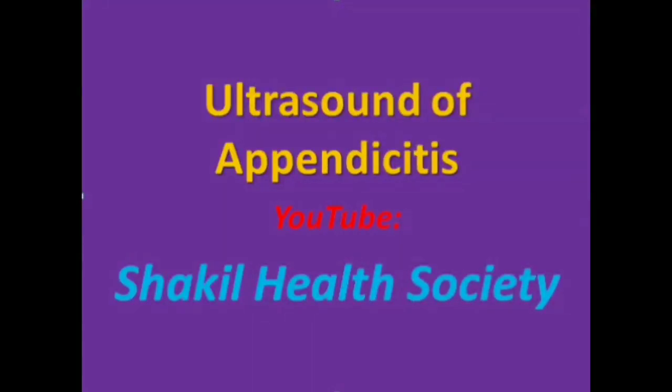Today I want to discuss the role of ultrasound in diagnosis of appendicitis.